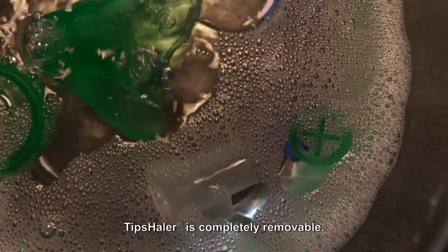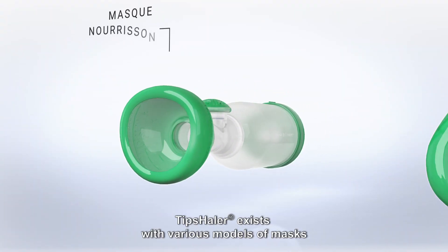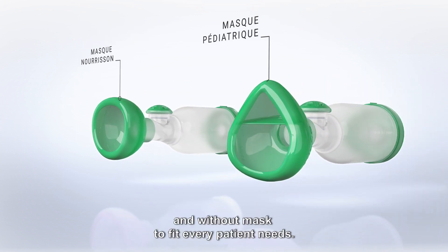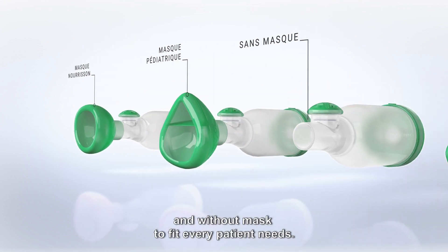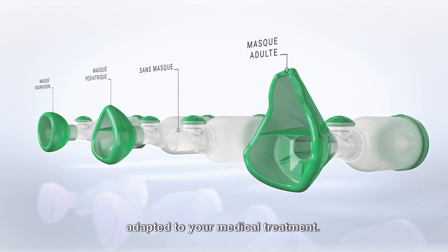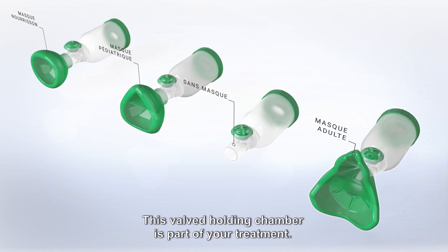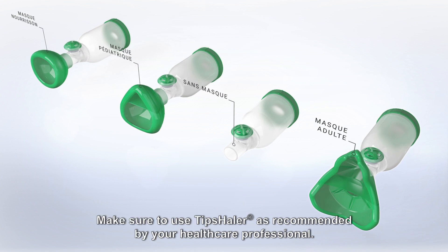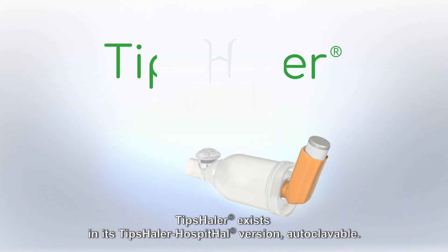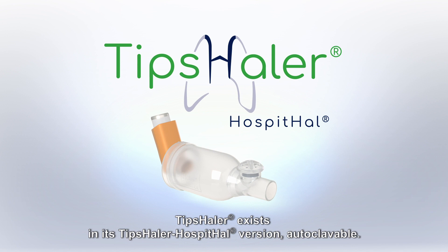TipsHaler is completely removable and exists with various models of masks and without a mask to fit every patient's needs. Your doctor prescribes the chamber adapted to your medical treatment. This valved holding chamber is part of your treatment. Make sure to use TipsHaler as recommended by your healthcare professional. TipsHaler also exists in a TipsHaler-HospitHal version that is autoclavable.